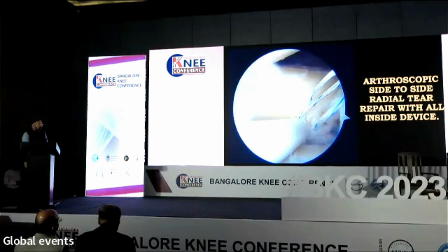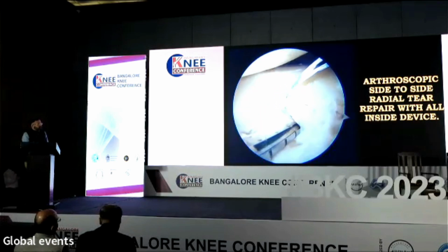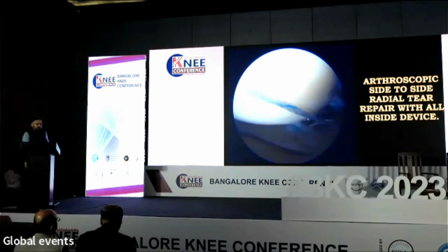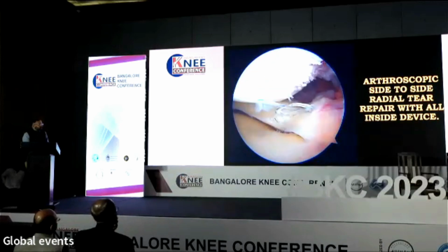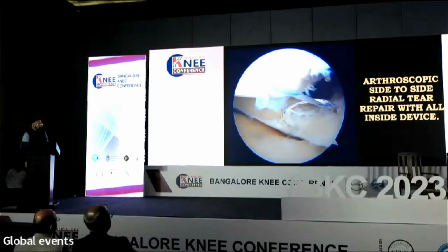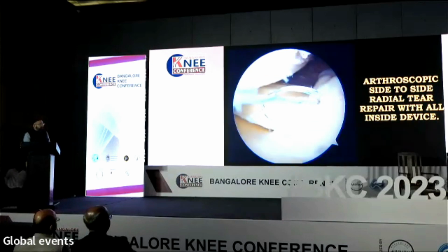The penetration should be as posterior as possible to the meniscocapsular junction. I'm not worried about the leftover tissue because after the approximation, you will see a nice contact between both the leaflets. The advantage of all inside devices is near the posterior horn and the root junction.